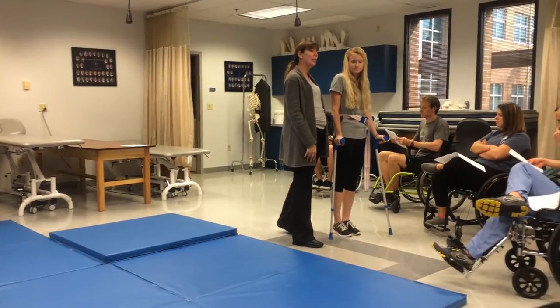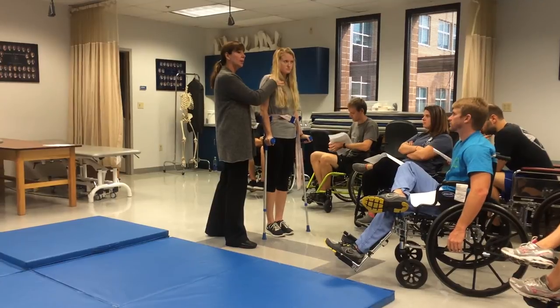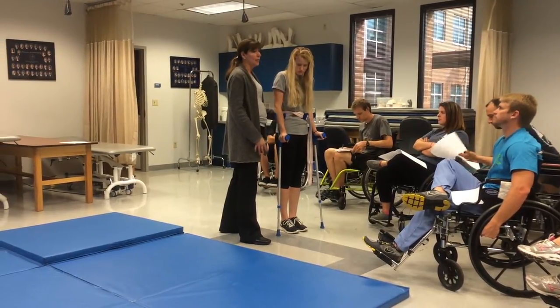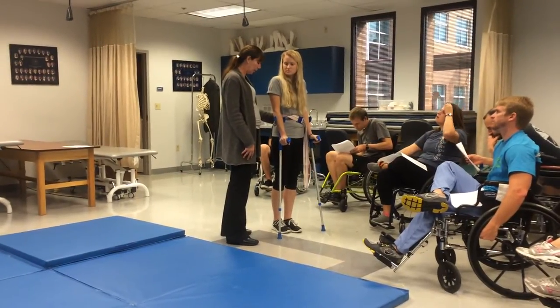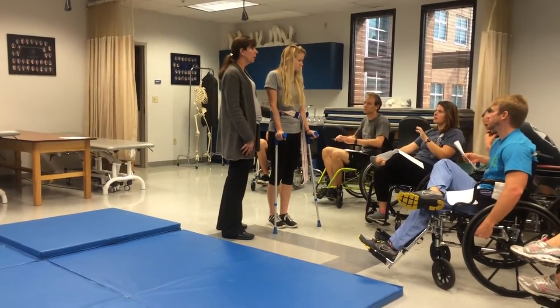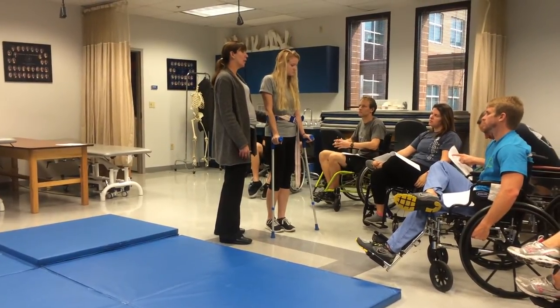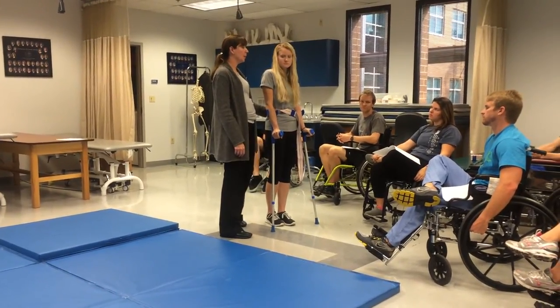As you get faster, you'll automatically get into a two-point gait. It's usually something you don't have to teach — it integrates with speed. It's better on their shoulders if they can progress to a four-point gait pattern. If they have a QL, you teach them to walk with a hip hike — that is a compensation they can use. It's better on the shoulders if they can do a four-point, two-point, or swing-to gait pattern.